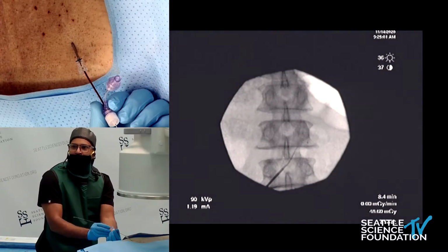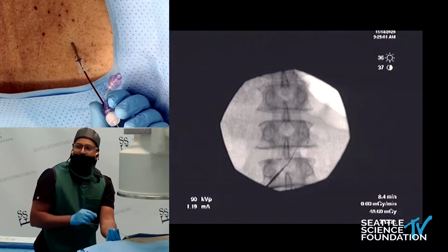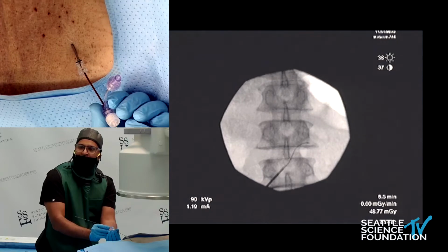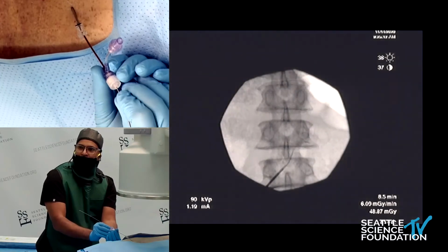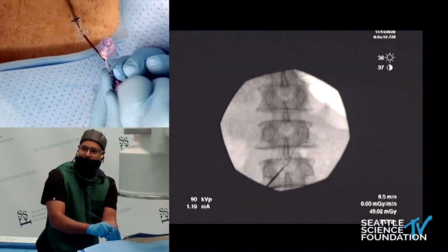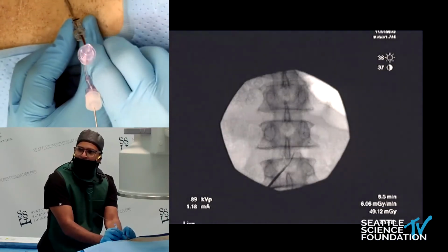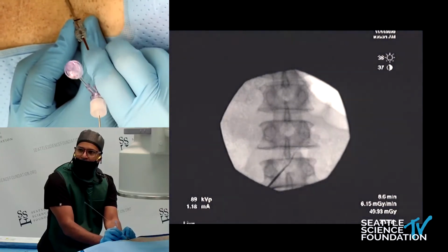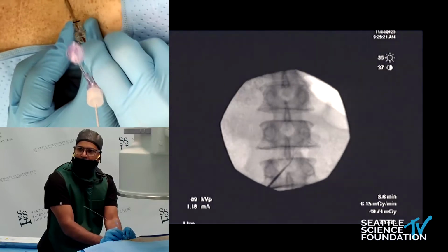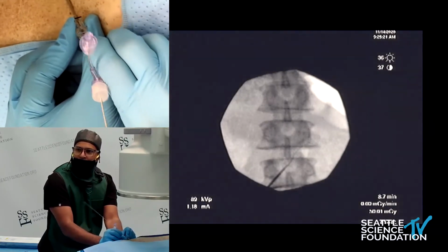Now, if we just stop right here, if you notice right under the pedicle, guys, there's a little dot. That's the tip of the sheath. So I need my guide wire to basically go out to it. You just saw right there. And now it's actually poking through it. But I'm just going to go to the tip of it, screw down the hub here so they're locked together. They're basically married. And then just push. Keep on doing the same thing. And now I'm hoping the increased rigidity will help. And we're just trying to work our way out.